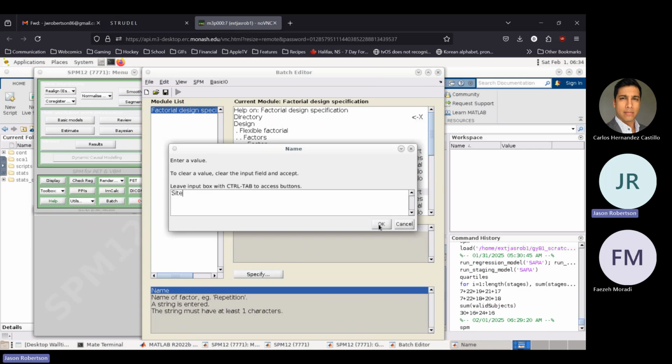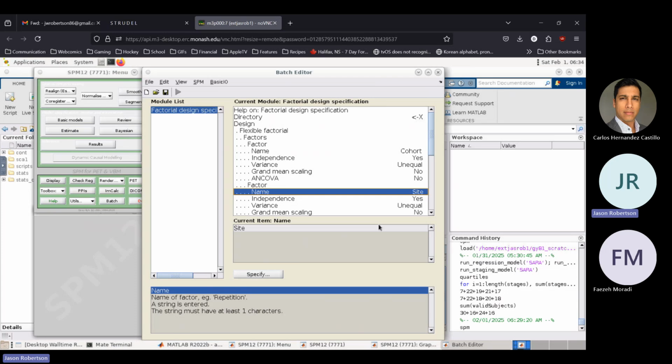Yes, the GLM on the FSL mostly. And there's an option for F tests, which for me was always a hard concept to grasp, and I don't know if you can explain a little bit. Like, why would you choose to have an F test? I know I've heard of an F test, but I've never used it personally. There is an option to do that when we get to running the contrasts. Yes, select it if you want, but I never.